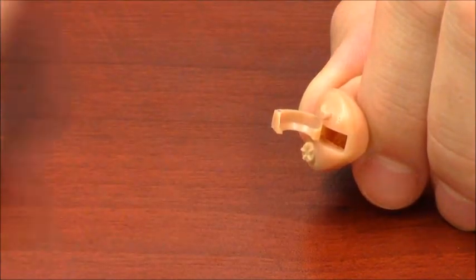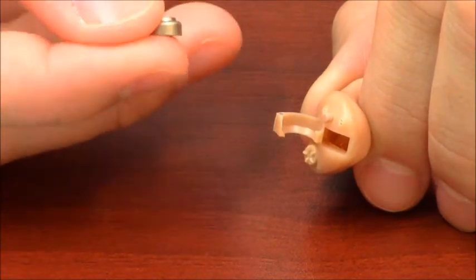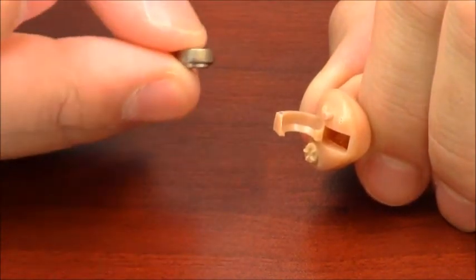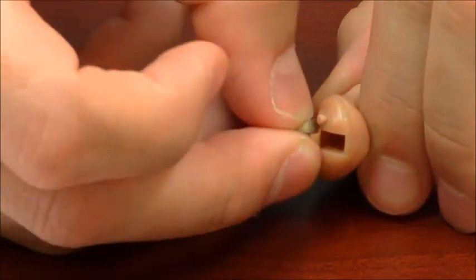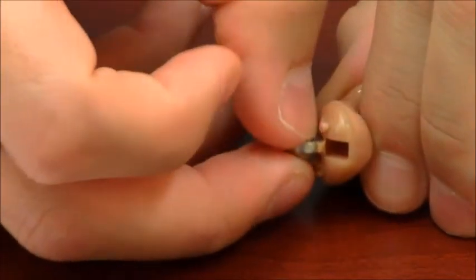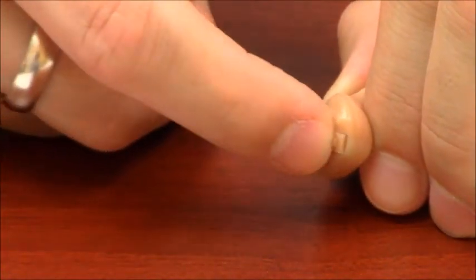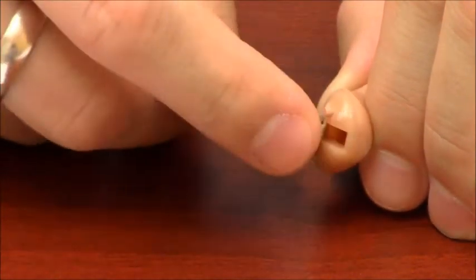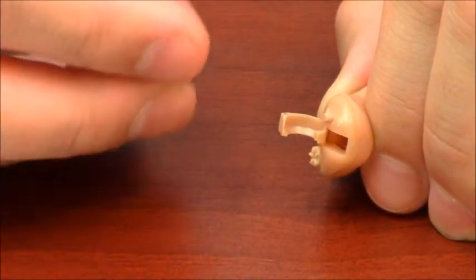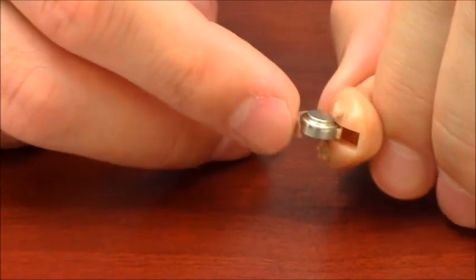When you're inserting the batteries, the ridge side of the battery will actually face the smaller opening, which acts as a cradle. And so once you push the hearing aid battery door in, it slides in quite easily. If you were to reverse the orientation of the battery, the door wouldn't close.